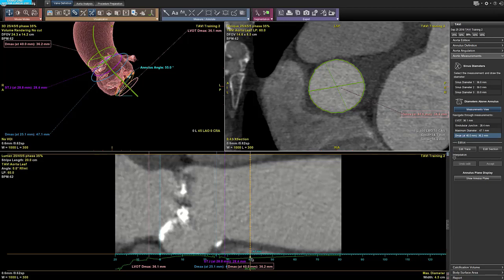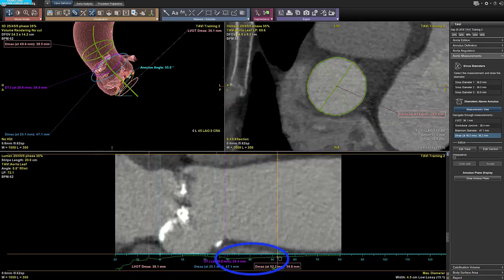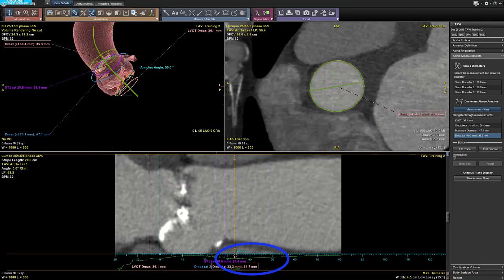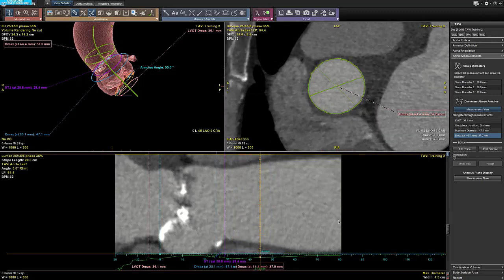To edit the diameter localization, you can grab the extremity of the diameter on the lumen view and move the diameter. You can use the additional tools on the wizard panel to either edit the trace of the aorta or do the section of the vessels.